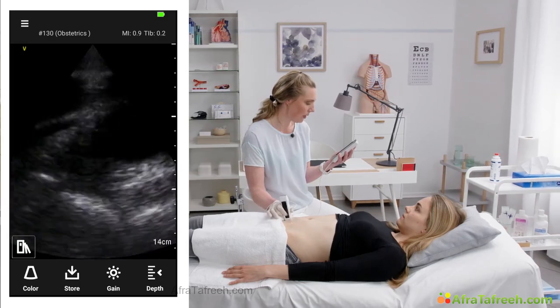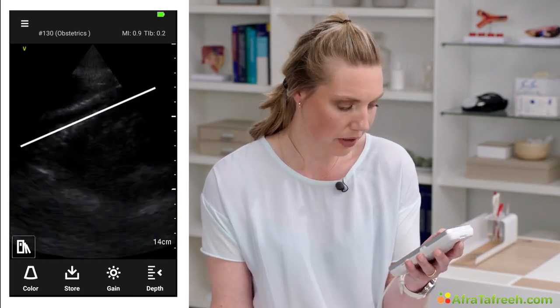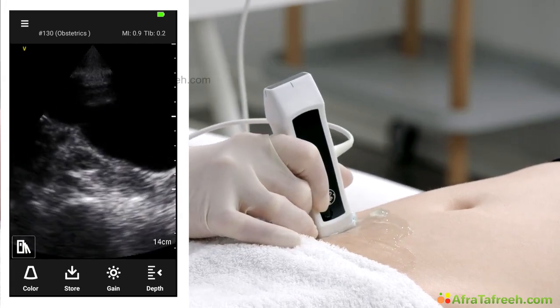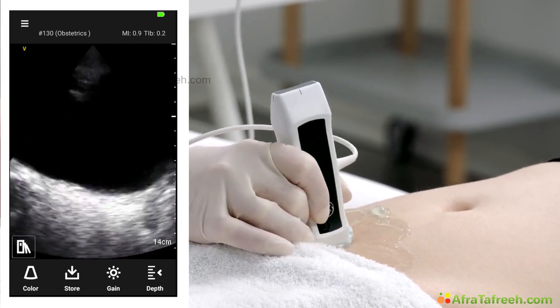Again, via the bladder towards the iliac veins. Here we see them on top of the image. Sometimes ovaries are very hard to find, but the only thing that you're sure of then is that they are luckily not enlarged. I showed you now the full pelvic area.